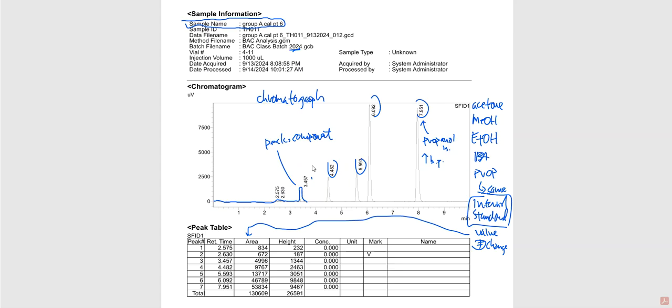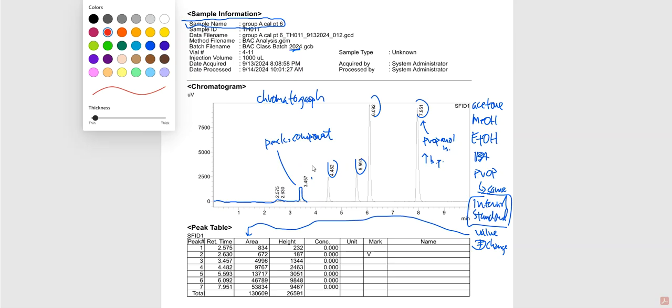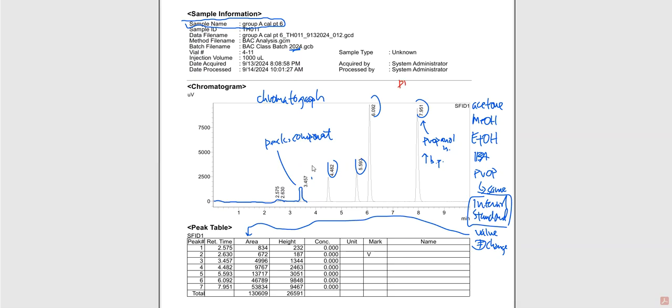Now, if I was unsure and if I didn't feel really comfortable, what could I do? Well, I could self-check myself. And the way that we do that is we get a propanol standard. I'm going to call this a very clean propanol-only standard that we should have injected in the batches and ran them. And that one peak, because there's only one thing in that solution, would show up, and we would probably see that that one peak for propanol would be around 7.9 minutes.